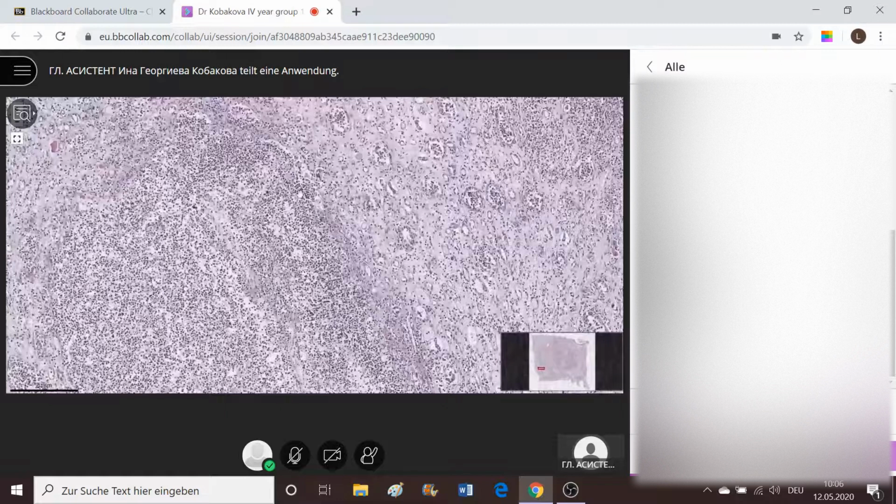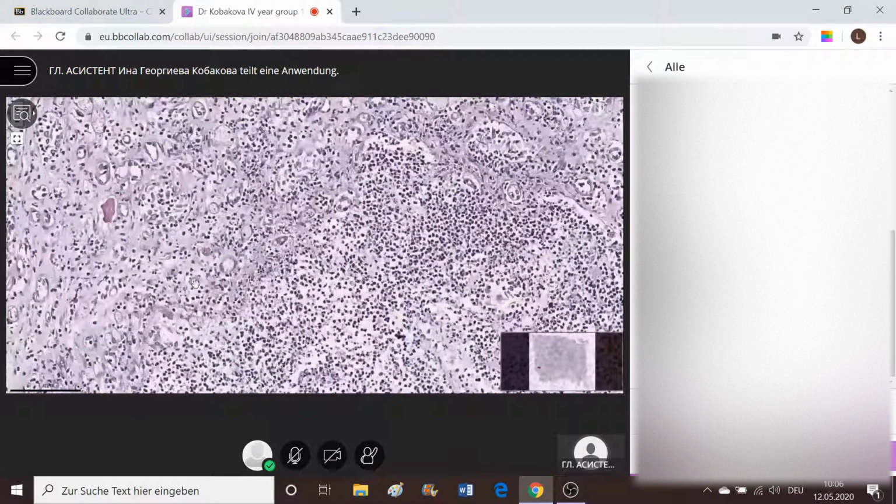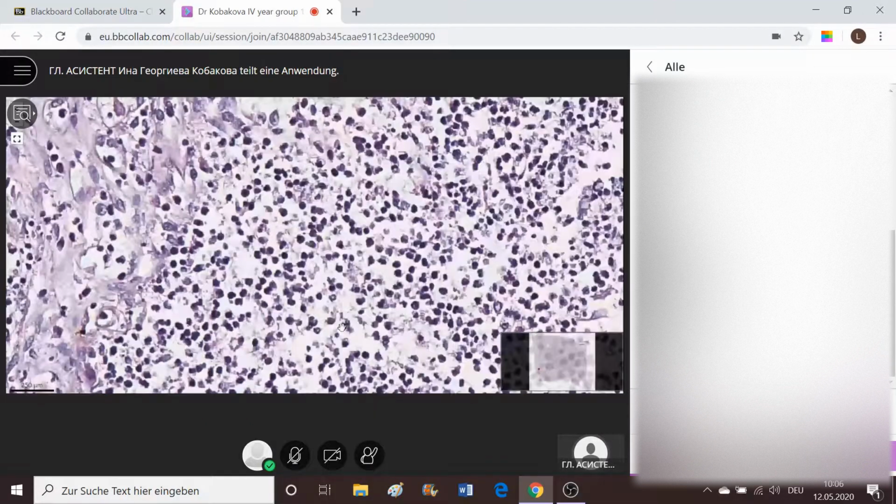and it's not an exclusion, and you should expect it in granulation tissue, to have lots of lymphocytes, which are the roundish inflammatory cells, small dots, right? The others, which are with segmented nuclei, those are the leukocytes, but that's completely clear for you. You're already a fourth year student, so you should be aware of this fact, and you are. So your and my diagnosis here would be acute pyelonephritis.